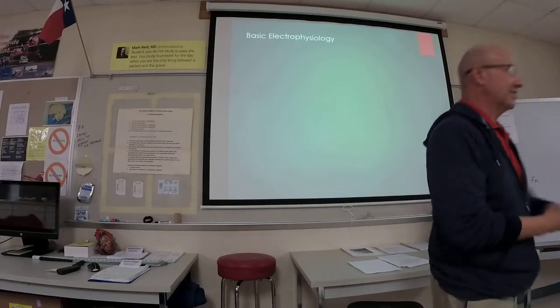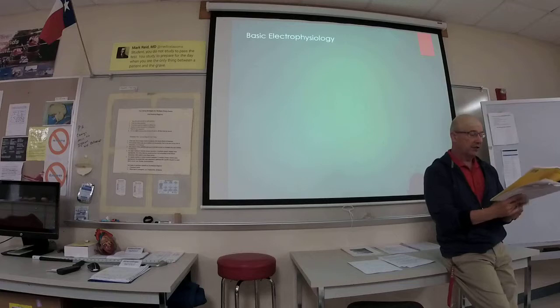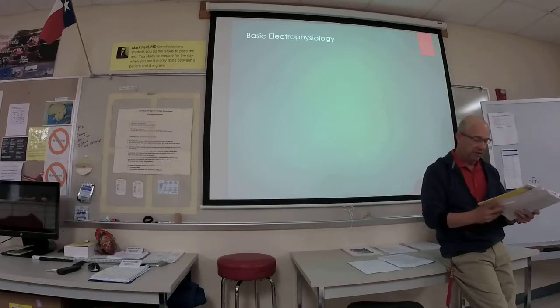Not really necessary if you just follow the rules of interpretation for an SVT. But you can do that. I've actually never seen anybody do that before. Or you can slow it down just to facilitate the interpretation, if you need to.